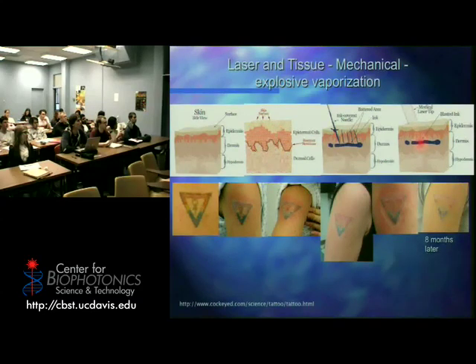But if you have a nice area with a bright yellow, okay, or a white, okay, which you can actually do white in tattoos, right? You can do that. You can do all the colors of the rainbow in a tattoo now, okay? So if you have one of those old style, Army Navy tattoos that was dark blue or black, like they used to do a long time ago, those are easy to get rid of. But if you have a nice, colorful, fancy one like they make nowadays, those are much harder to get rid of because you can't get that pigment to absorb very much energy.